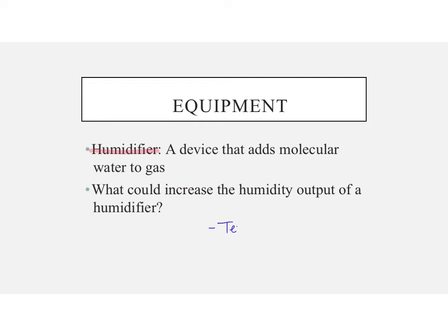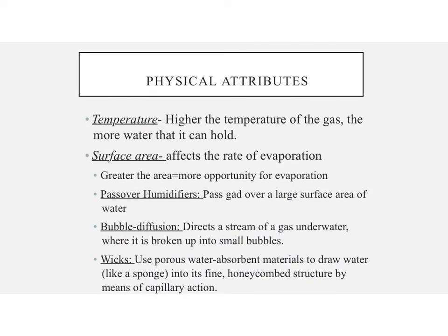temp, surface area, time of contact, and thermal mass. So we will go more in depth with what we increase to help increase humidity output.